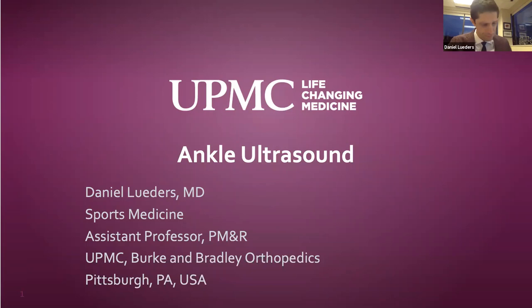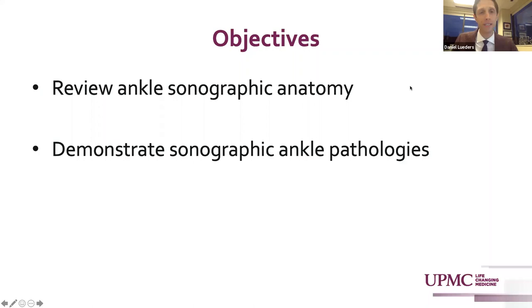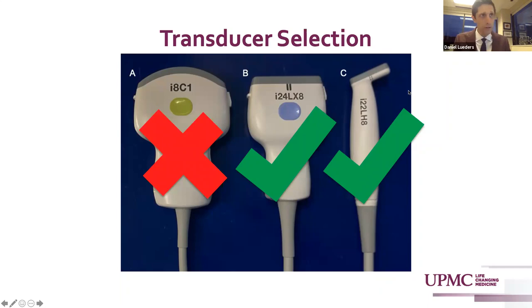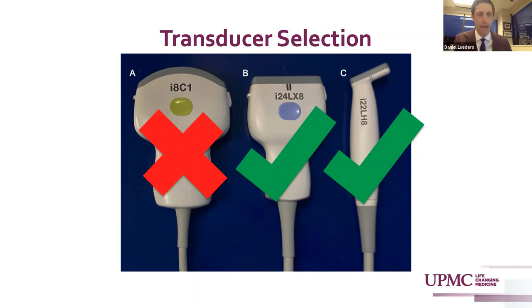The foot and ankle are superficial structures and so are really amenable to the use of ultrasound in evaluation. Because of their superficial nature, you're going to use a high-frequency linear probe. Given the bony contours and sharp contours of tendinous anatomy, often your small footprint linear array transducer will be your go-to. Something like a hockey stick transducer will allow you to get into the nooks and crannies of a foot and ankle to maintain visualization of your intended structure.